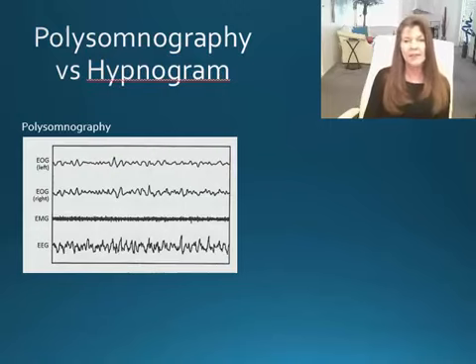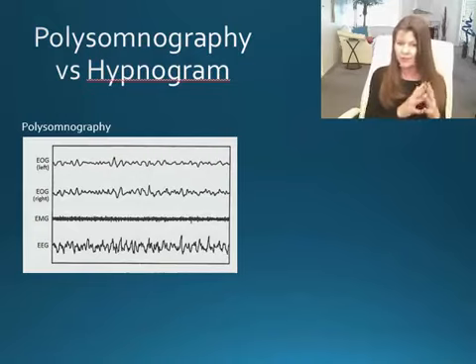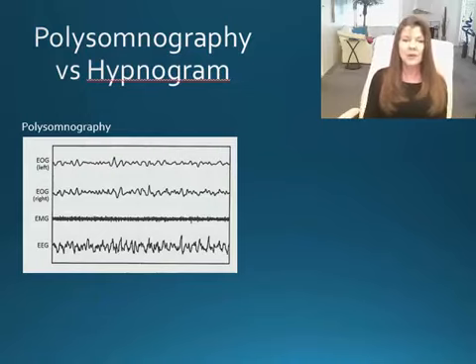This is in fact N3, stage 3, and it is especially apparent looking at the size of the EEG waves. We're going to cover these stages next. And of course, a clinical polysomnography shows the same plus additional measurements needed to diagnose specific disturbances and disorders.